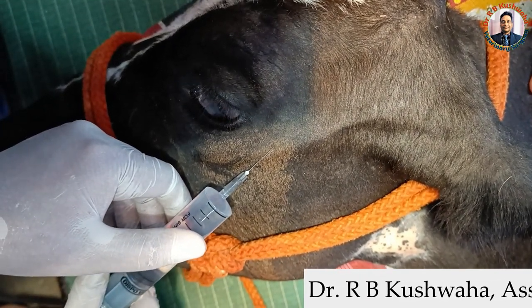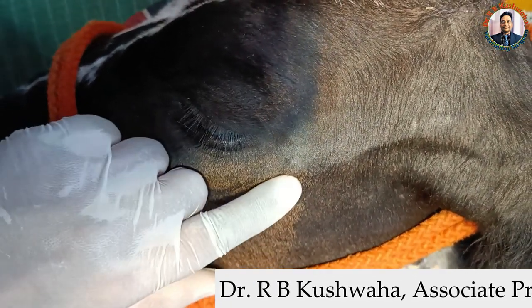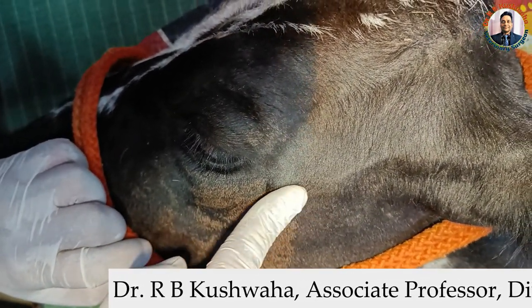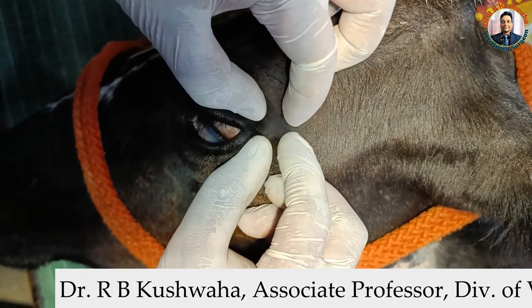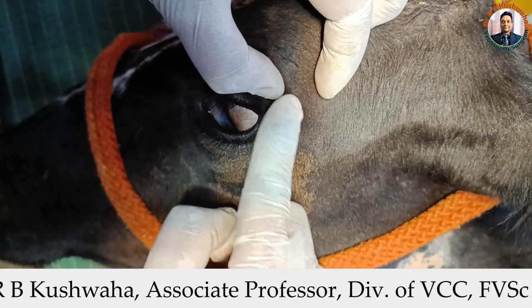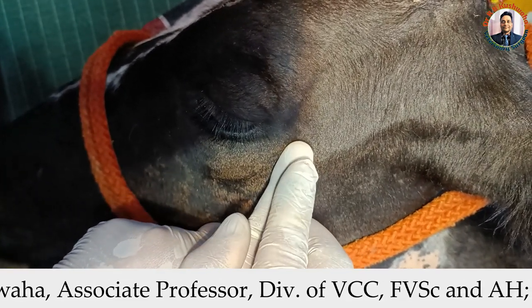If you want to induce the block, simply infiltrate 1 to 1.5 ml of local anesthetic solution here. The landmark for this is the zygomatic arch and the supraorbital process of the frontal bone. Both of these meet at a junction, and that junction is basically the point of insertion of the needle.